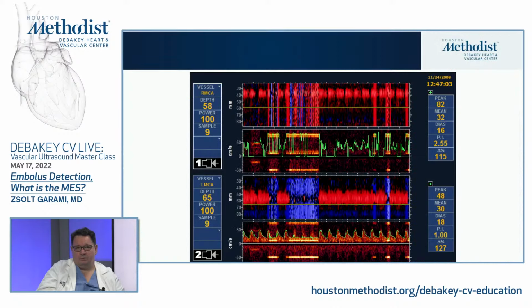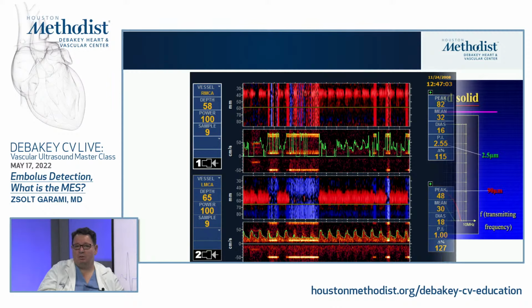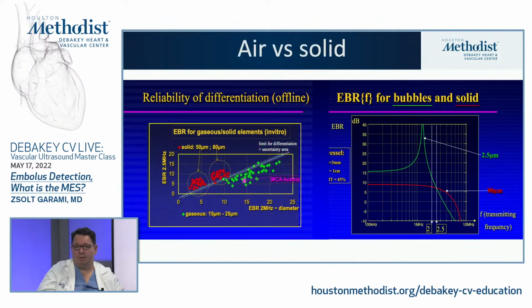So here is a beautiful signal, bilateral monitoring, and these are just cutting artifacts. So again, sometimes you don't see what's in the waveform. Sometimes you need to really look hard to see those emboli.